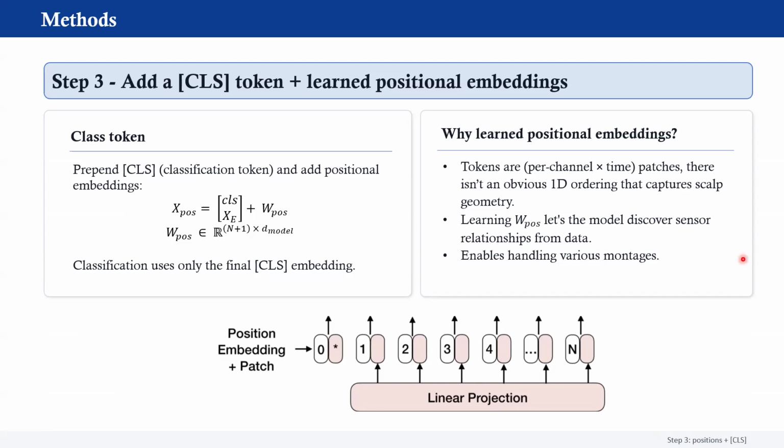So in an EEG, how and where you place your EEG sensors is dictated by a montage. Now, there are different montages that tell us where particular sensors should be positioned. And when that montage changes, it can make it difficult for certain models to handle the input. So what they are claiming is that our model can do that.